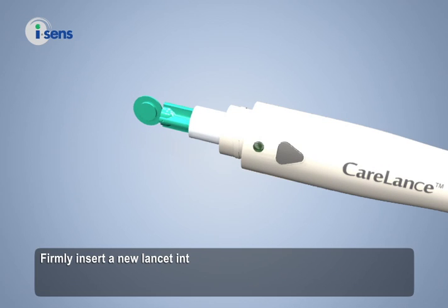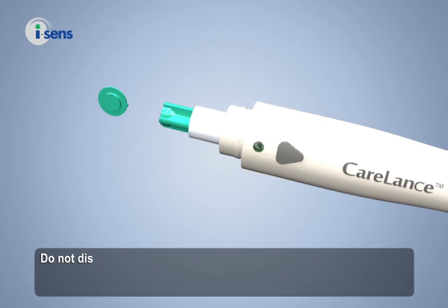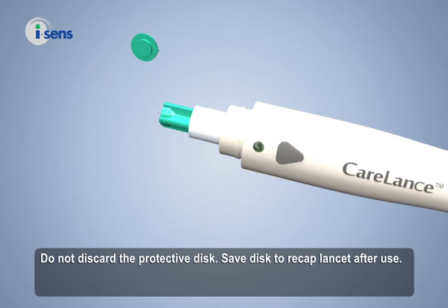Firmly insert a new lancet into the lancet holder. Hold the lancet firmly and gently twist to pull off the protective disc. Do not discard the protective disc — save the disc to recap the lancet after use.